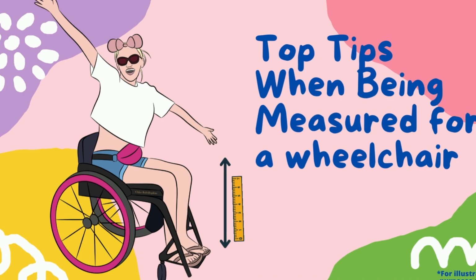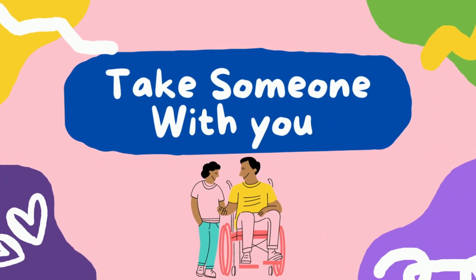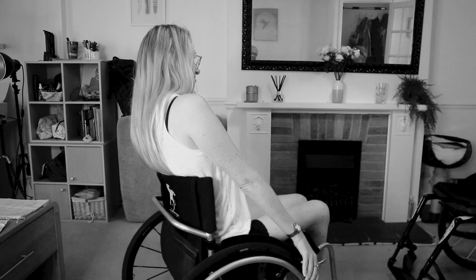So, okay folks, get that iPad, get that pen and paper, because it's time for my top tips. Take someone with you when you go for your fitting appointment. It's a long time, you might forget things. They'll be there to support you and remind you of things. It's just an extra pair of eyes and ears that can help you advocate for what you're after.